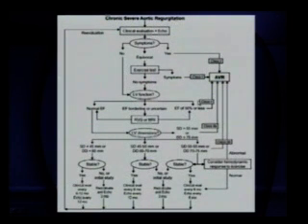So two or three things come out from this algorithm: you need to know the size of the LV, not just the jet of the aortic regurgitation, not just the vena contracta, but you need to know LV size. And I still think that a good M-mode echocardiographic cut of the LV in the parasternal long axis view gives you a very accurate idea of LV dimension, and therefore you can keep in mind whether it is more than 55 millimeters systolic dimension. That will give us a very good idea. So this is an algorithm for when to think the patient should go for surgery.